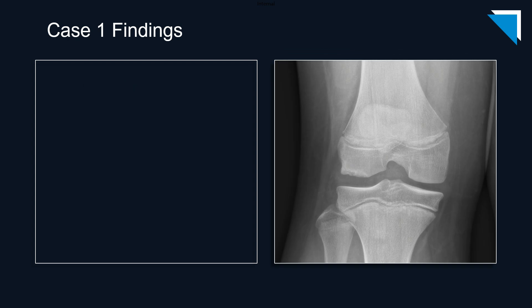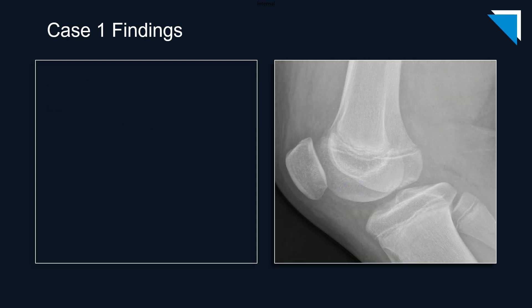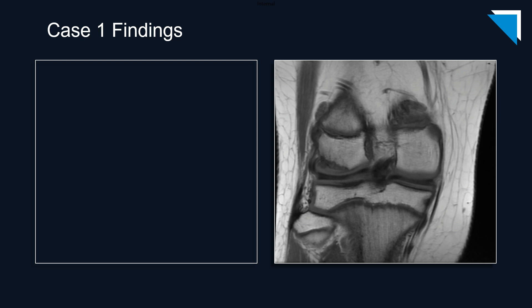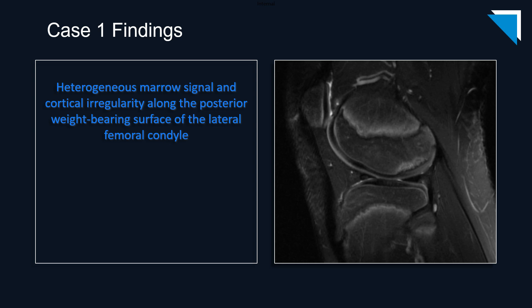Let's return to the radiographs to review the findings. There is cortical irregularity along the lateral weight-bearing surface of the lateral femoral condyle. The lateral view helps us more accurately characterize the location of the finding to the posterior lateral weight-bearing surface of the lateral femoral condyle. The same finding is clearly evident on this coronal T1-weighted image from the MRI, and here it is again along the posterior lateral weight-bearing surface of the lateral femoral condyle on this sagittal fluid-sensitive image.